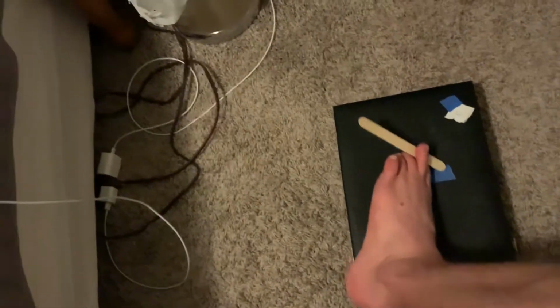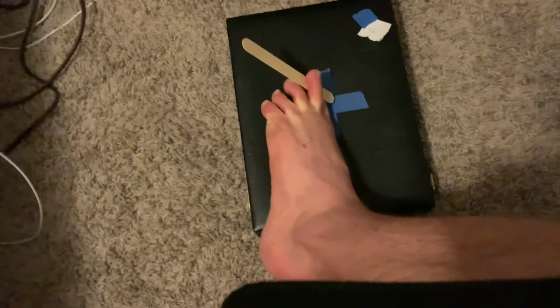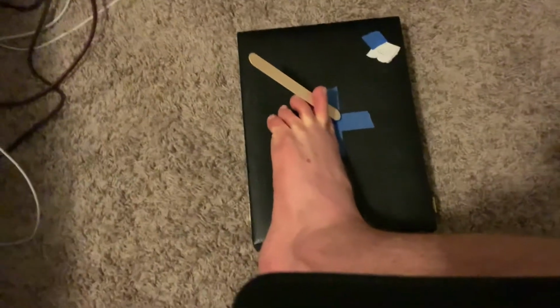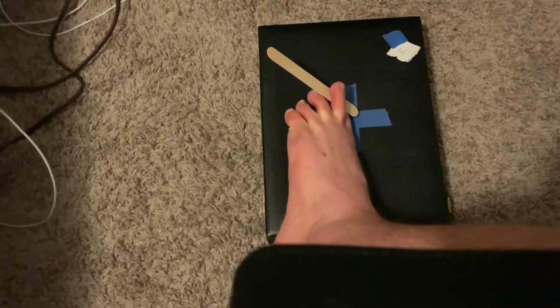And our central ray will be directed through the midpoint of the desired toe, like that. And this will give us a lateral view of the phalanges of the toe, as well as the interphalangeal joints and the metatarsal phalangeal joint.